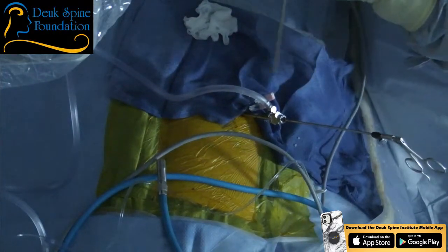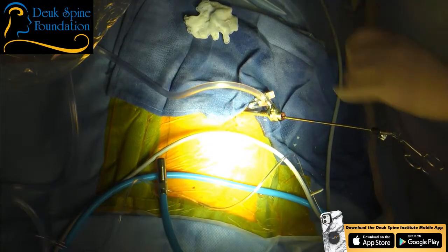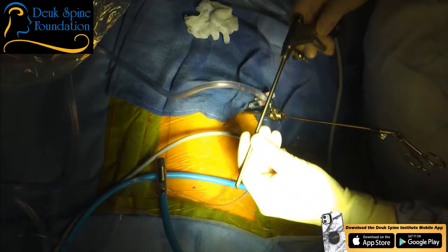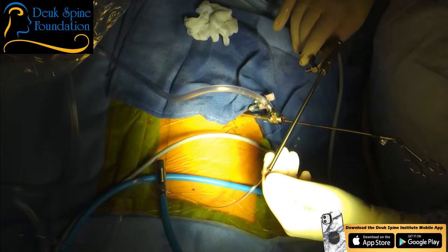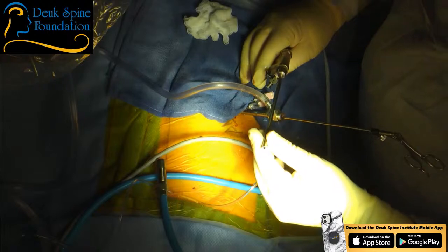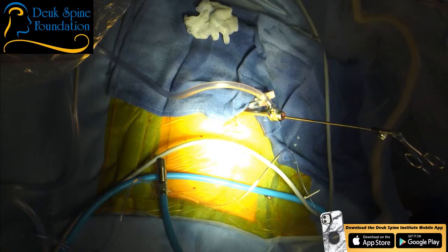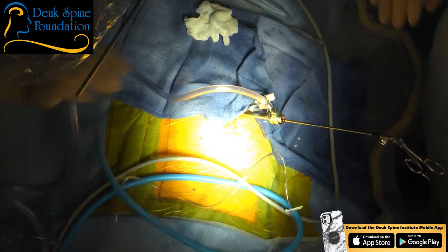And what I mean by repair is when these little lenses shift inside the tube. Can you see, Sean? Yes, we can. You see this scope? Yes. There's a lens system inside that runs from a lens here to a lens here, and one of those lenses has shifted its position, I believe, which explains why. And it does happen because they're glued in there, and the glue gets old after a while of use.